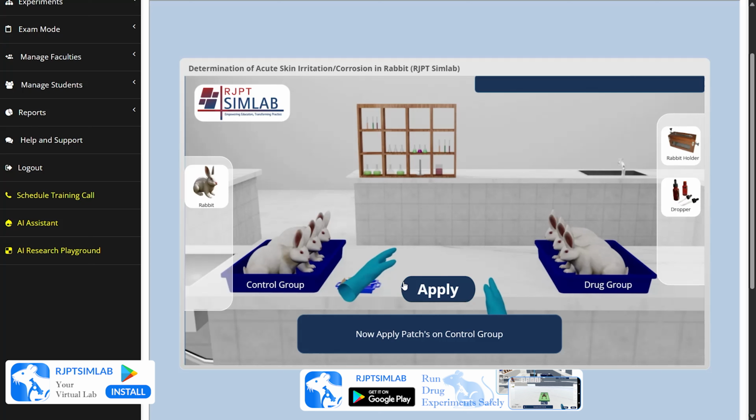As we can see here in the laboratory table, we have a control group and a drug group. In the control group, we have three rabbits over which we will not apply any test substance. And in the drug group, on the right side, we will apply the test substance and then observe the reaction. So now let us perform the experiment.